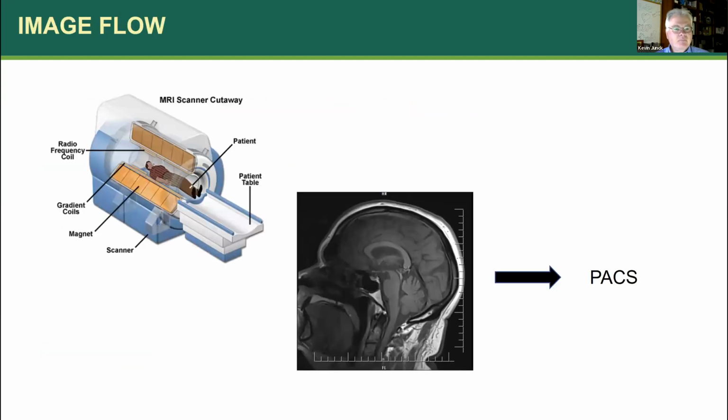Okay. All right, so let's talk about a couple of other items, a little bit more specific now within the radiology sphere. So I'm talking here in general about an MR scanner and an image flow, thinking through where these images need to go to various systems downstream. Maybe it's pretty simple. An MR scanner generates a bunch of MR images, and all I've got is one place to send them to. I send them to my PACS, everybody looks at the images, and we're all good to go.